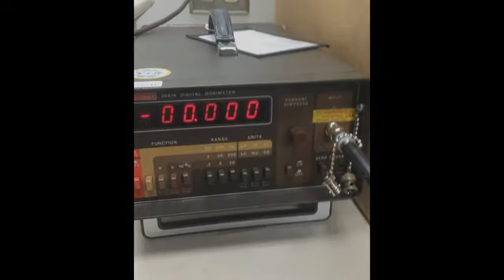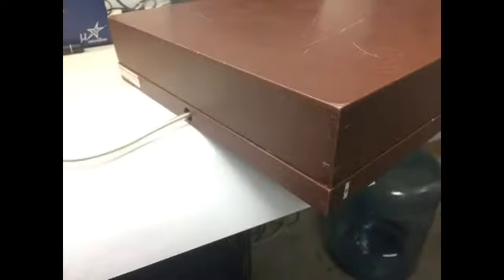Once you get that hooked up, the chamber itself inserts here into some kind of medium. This is water equivalent plastic, and then that goes under the beam. Under the beam, you put it on a stack like this. So you have plastic on top of the chamber, and so you can control what depth you're measuring at.